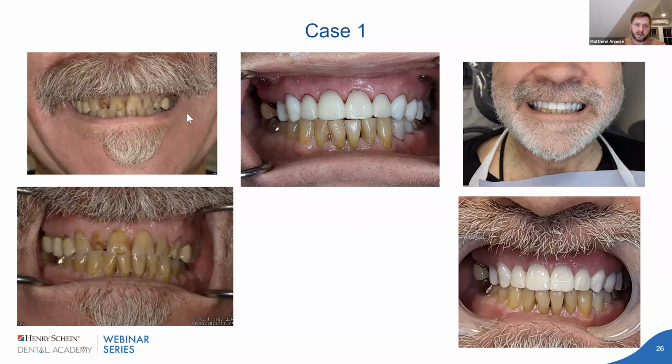This is just prepped everything. We saw where his bicuspids are going past his lip line. His incisal edge position was nice. So it's a straightforward case, and we just change the shape, contour, color, size, and then basically I copy this and tell the lab, here it is.